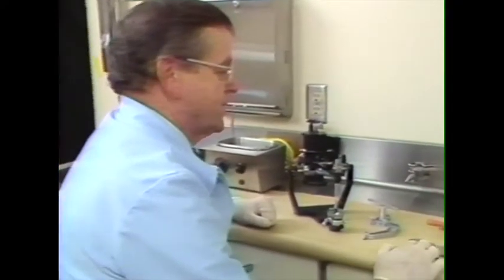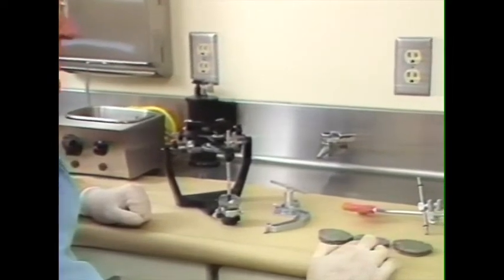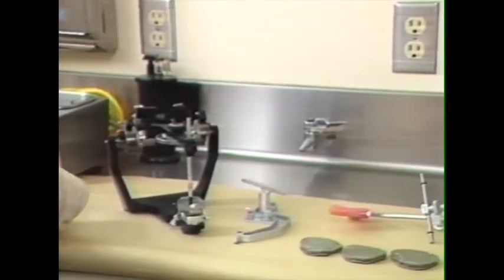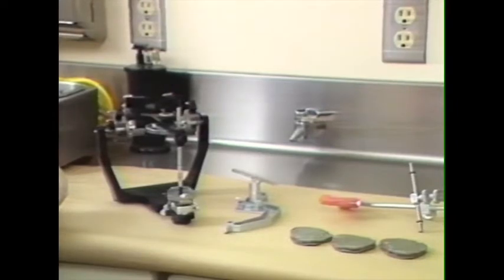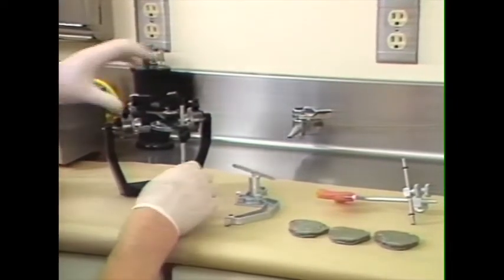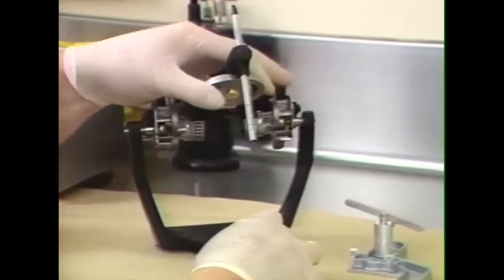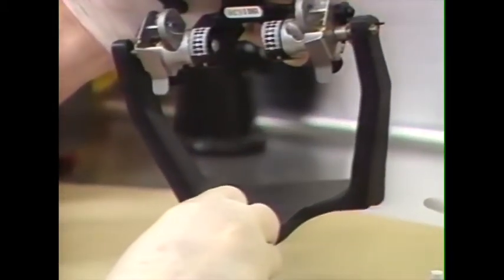Before dismissing our patient, we secured a centric relation record, a left lateral positional record, and a right lateral positional record, in addition to our facebow record. These can be transferred to the laboratory, or if the dentist is mounting his own casts, they are now prepared for mounting. We are going to mount the cast in the Hanau Model 190 modular articulator with, in this case, adjustable Bennett fossae.